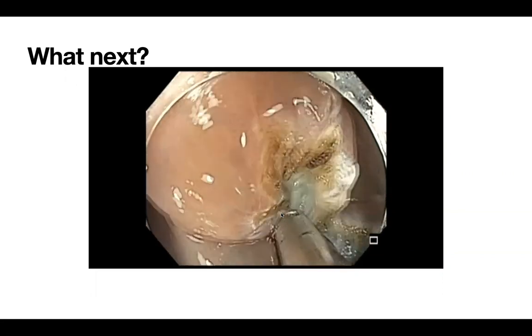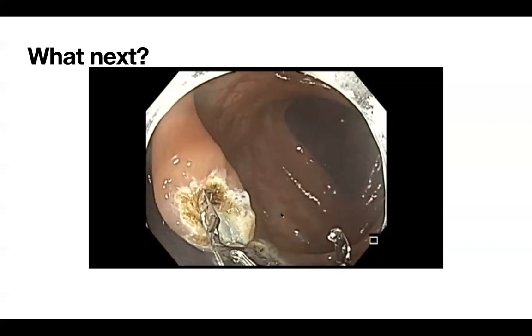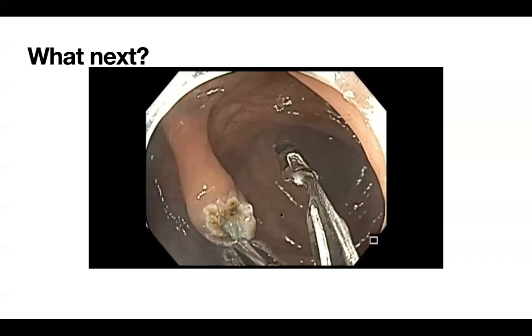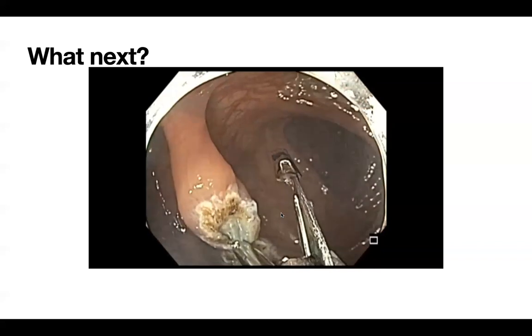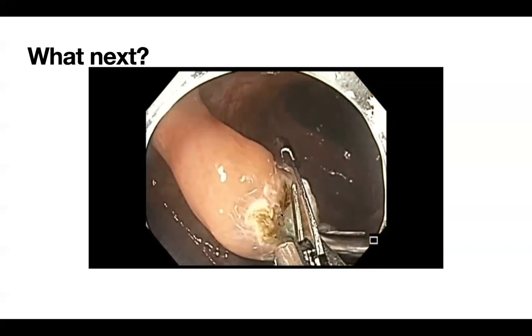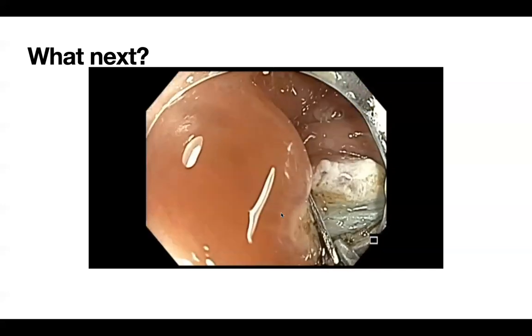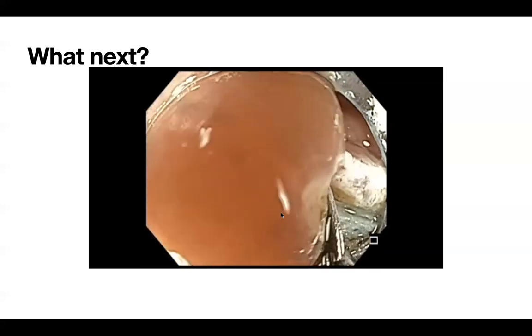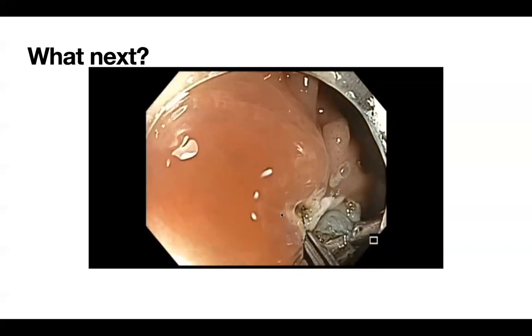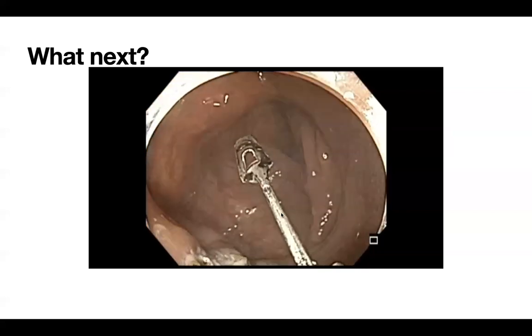And here we decided, as you can see from the first clip application, you don't see the lower blade with the cap, and not seeing the lower blade when we first applied, you can actually push the edges together and apply a deep closure. Most important thing is when you apply clips, it's not clip application. It's a deep approximation of the edges, because all these clips can go deep and include the muscle into your closure. So something to keep in mind.